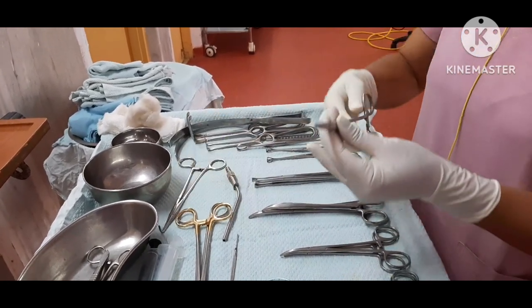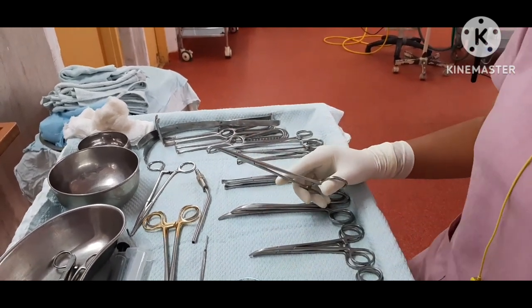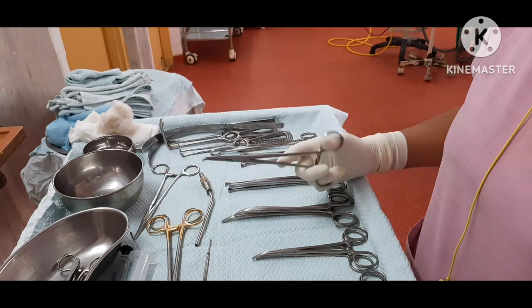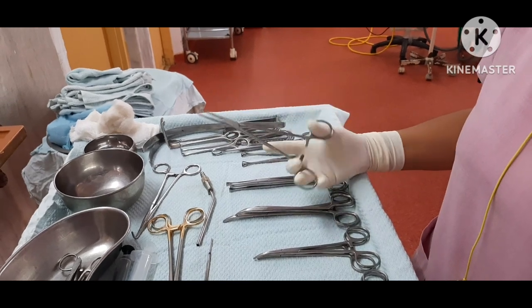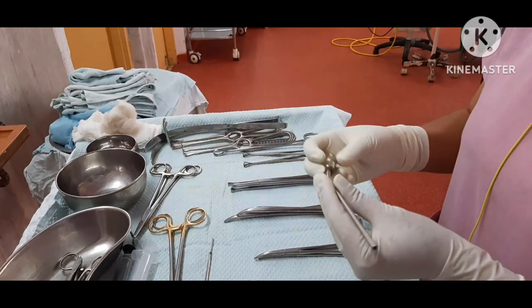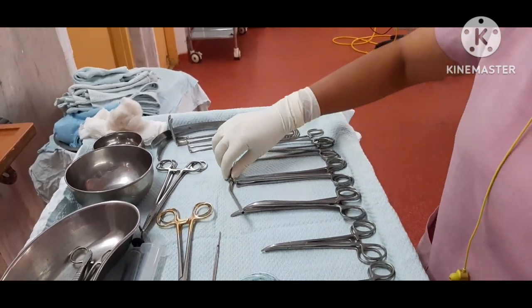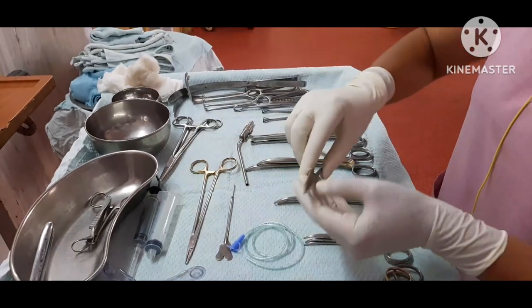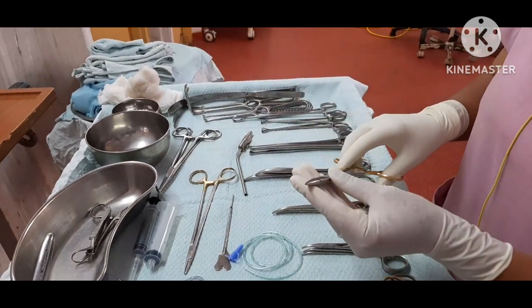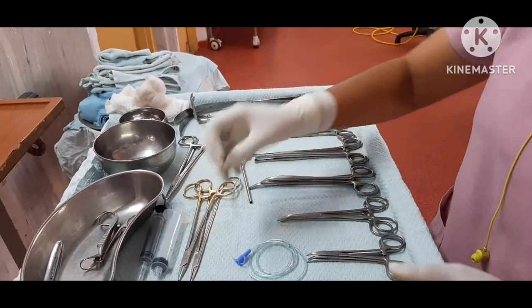Right angle forceps. Suction cannula. We have two needle holders — two-zero and three-zero needle holder. And this is a butterfly cannula.